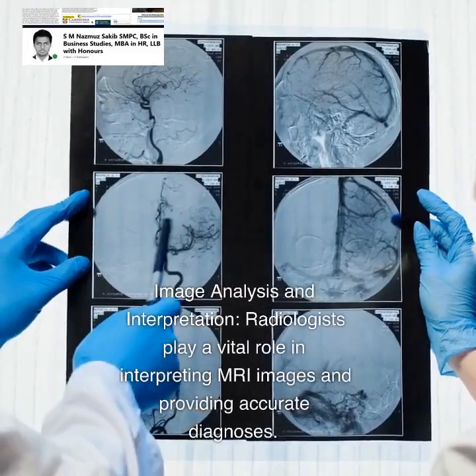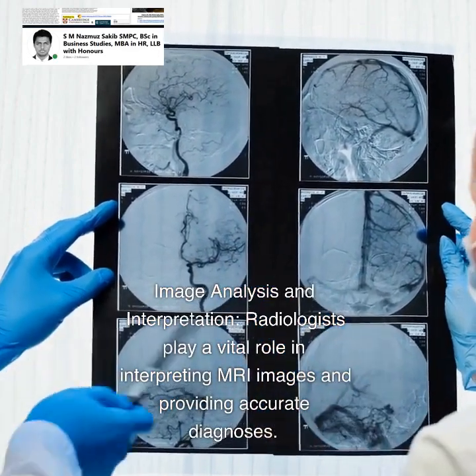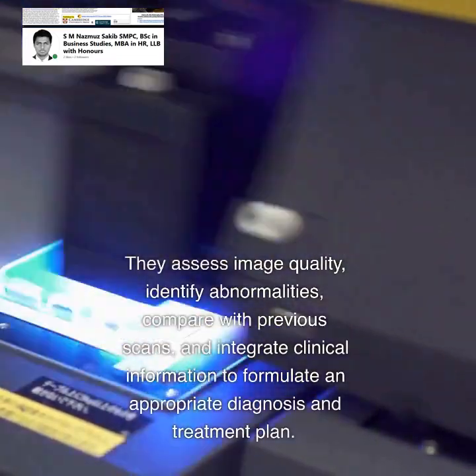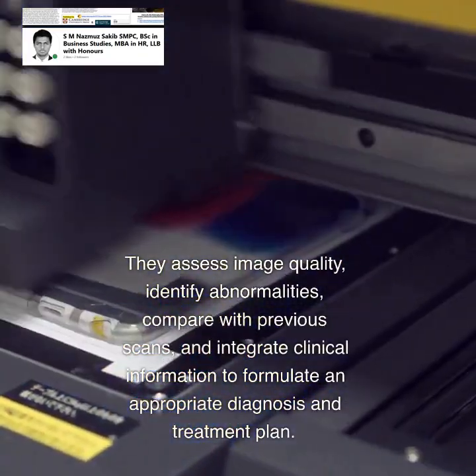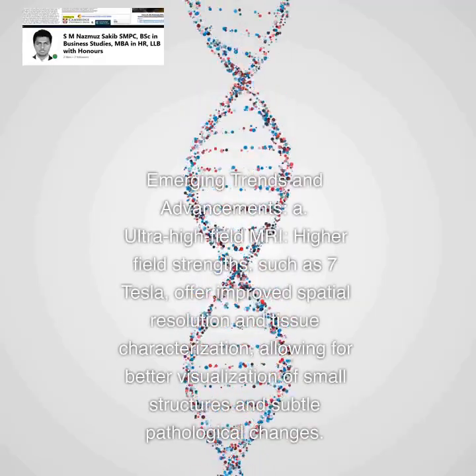Image analysis and interpretation. Radiologists play a vital role in interpreting MRI images and providing accurate diagnoses. They assess image quality, identify abnormalities, compare with previous scans, and integrate clinical information to formulate an appropriate diagnosis and treatment plan.